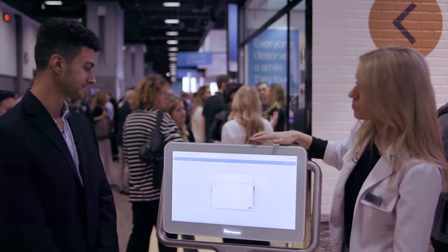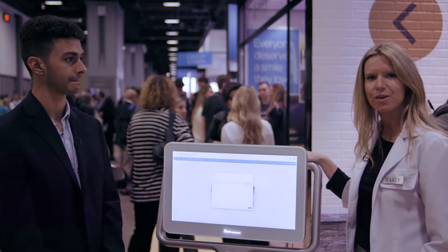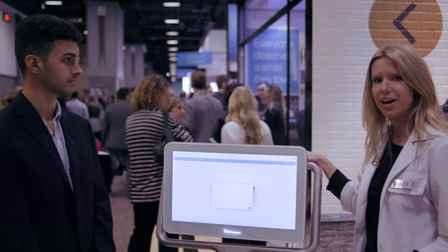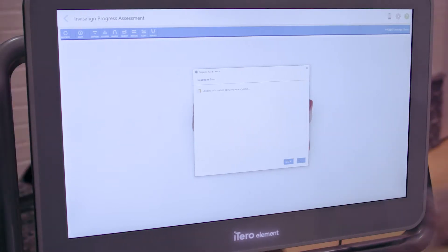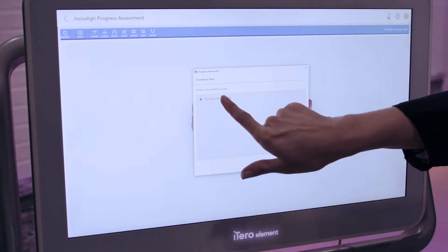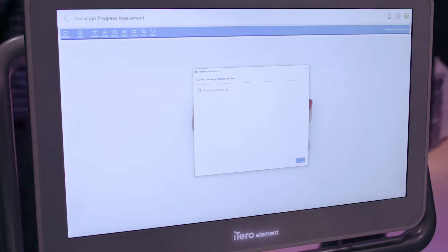Absolutely. The progress assessment works by the doctor performing a quick scan on their patient, and they're going to be able to see immediately how that patient is tracking throughout their Invisalign treatment. They can choose their patient here, then choose the ClinCheck that the patient is in, and when they hit next they're going to get a color-coded diagram showing them exactly how that patient is tracking throughout treatment.